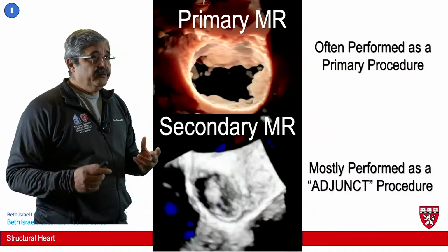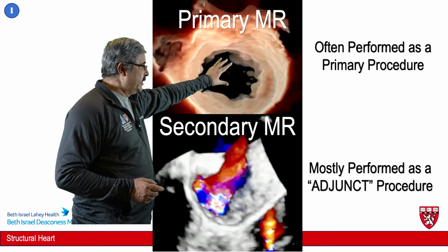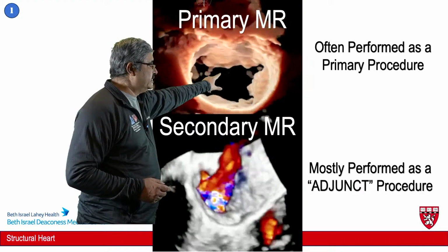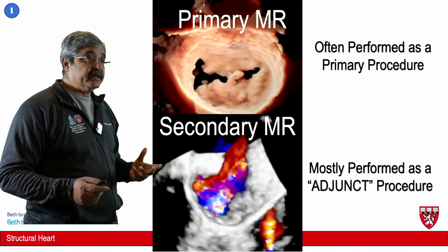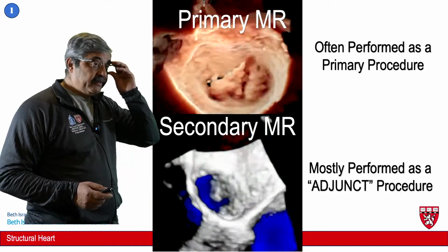So the dilemma over here is primary mitral regurgitation. As you can see in this situation, there's the three-dimensional image of the mitral valve. This is the posterior scallop, and you can see a lot of torn chordae. So this is primary mitral regurgitation. This is a very frequently performed operation as an isolated procedure, and a lot of patients get primary mitral valve repair when they only have this problem.